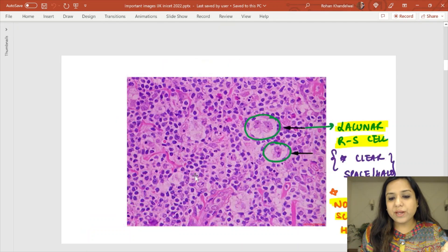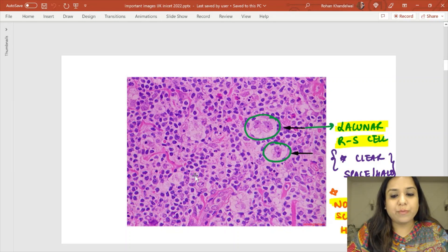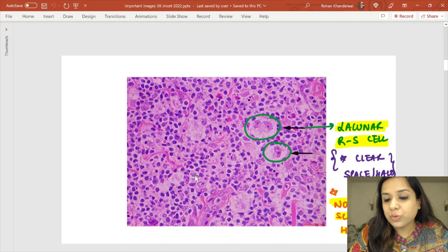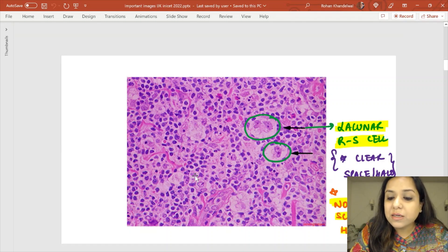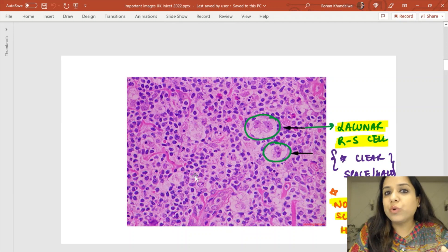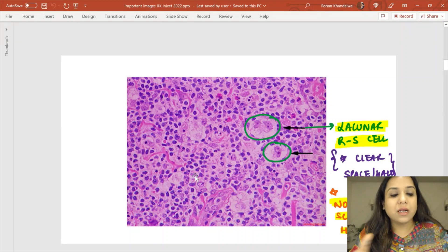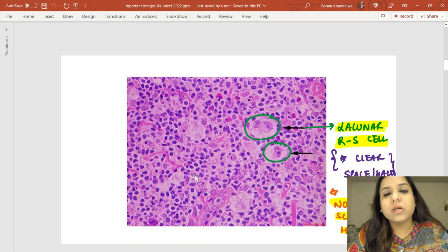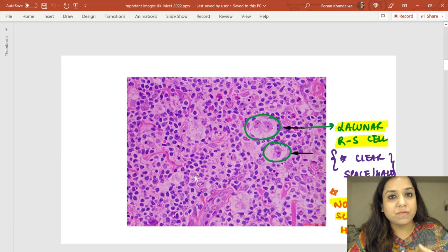There are two other variants. One is the lacunar Reed Sternberg cell, where there is a clear space around a binucleate or mononucleate cell — that clear space is called a lacuna. This lacunar Reed Sternberg cell is seen in nodular sclerosis Hodgkin's lymphoma and is also CD15 and CD30 positive.